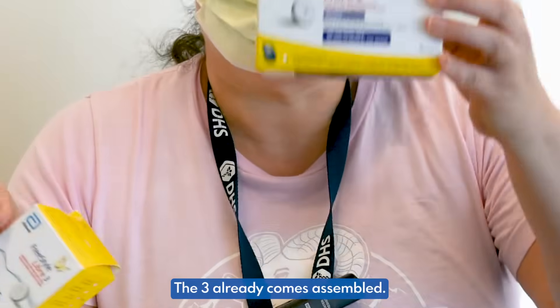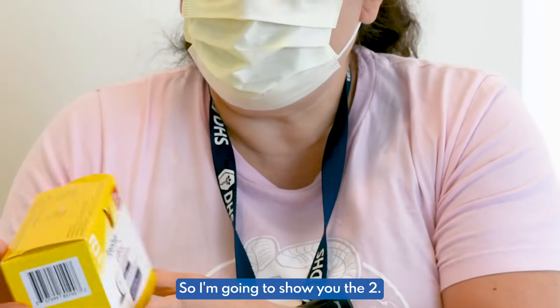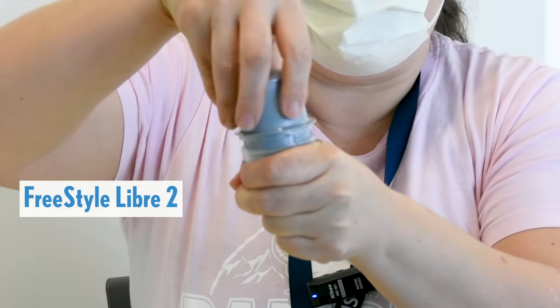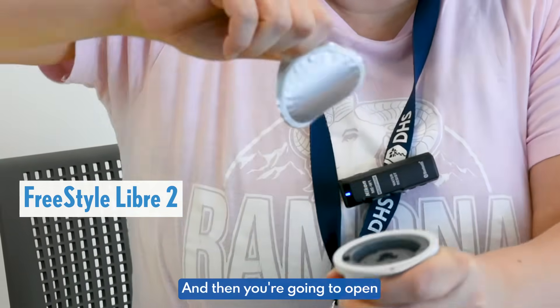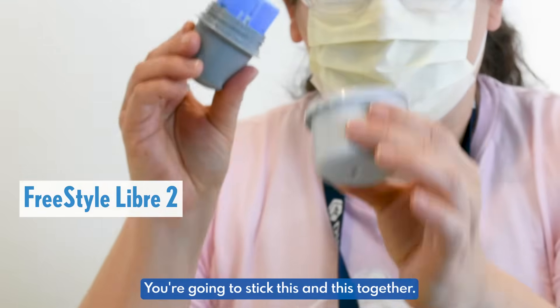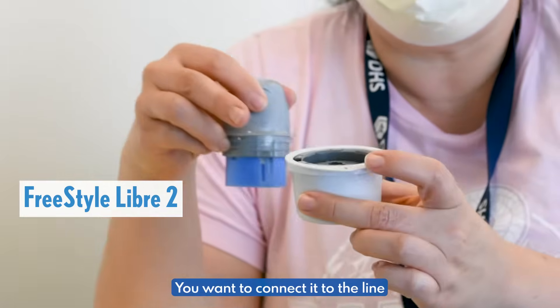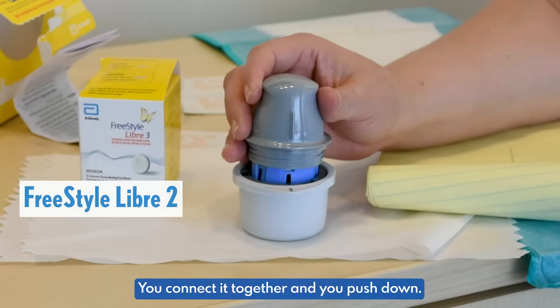The Libre 3 already comes assembled; the Libre 2 you have to assemble yourself. So I'm going to show you the two. You open this one and you're going to see that there's a little sticker there — don't touch that sticker. Then you're going to open the sensor part. You're going to stick this and this together. You want to look at the line right here, connect it to the line right here, push down.